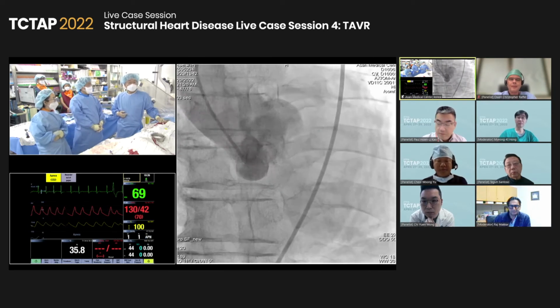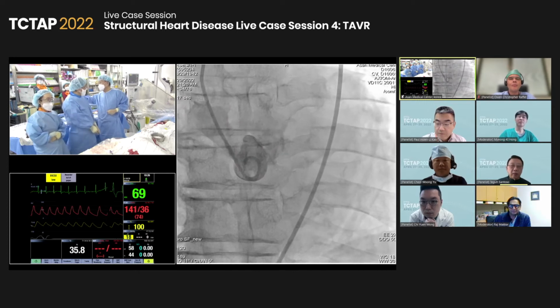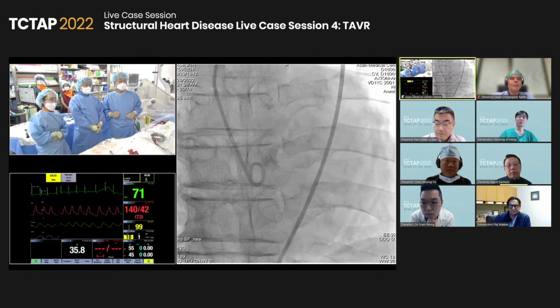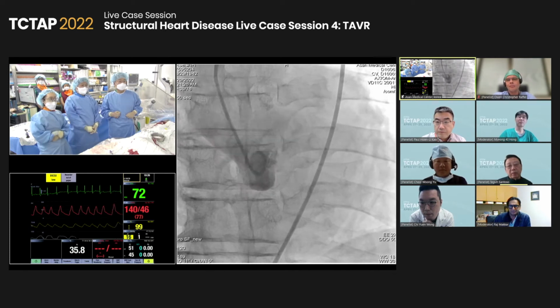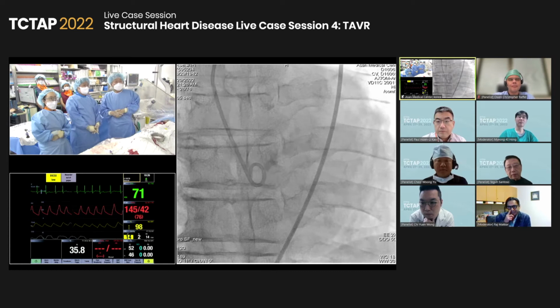What about Dr. Tegu? Yes, I completely agree that we can choose either a self-expandable or balloon expandable valve. If I'm in your position, I would do the case without the balloon pre-dilatation. Yeah. All right, I would agree.